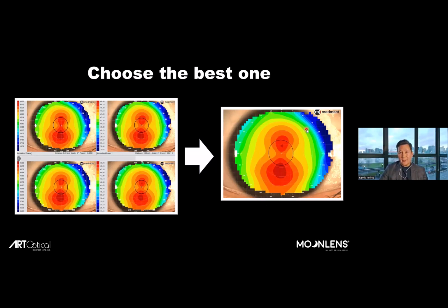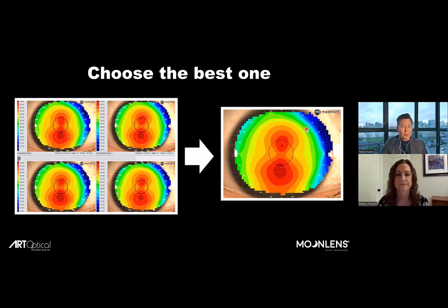And Bethany, could I ask you to come on with us a bit and tell us your perspective on the importance of this baseline capture. Am I exaggerating how important this capture is? And could you share with us some of your thoughts?